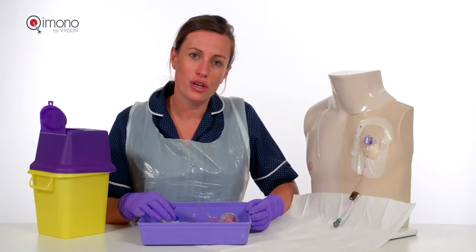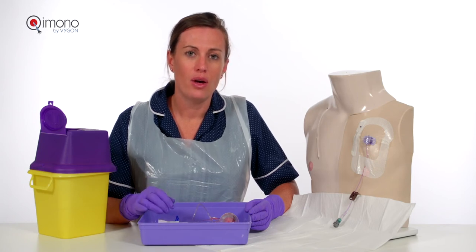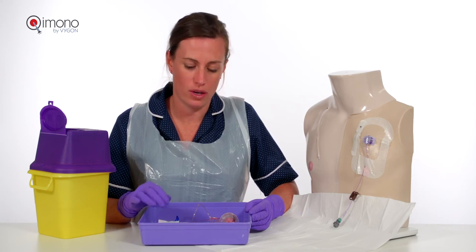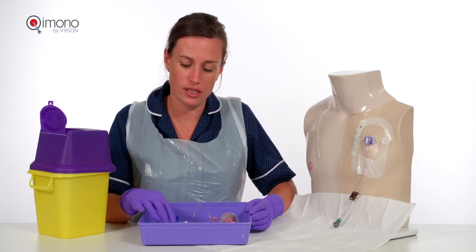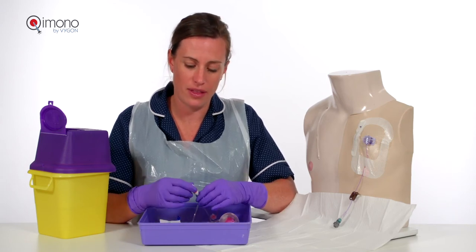This clip is with regard to ambulatory device connection. You can either have an elastomeric pump or a cassette — either will work with the Vygon closed system transfer devices due to the luer connections and their compatibility.